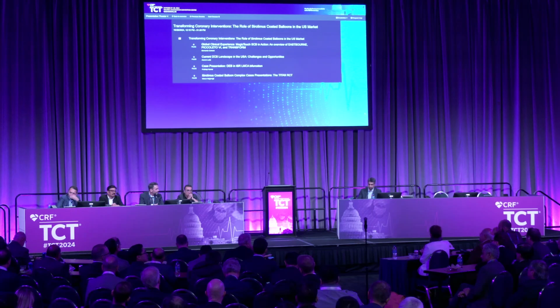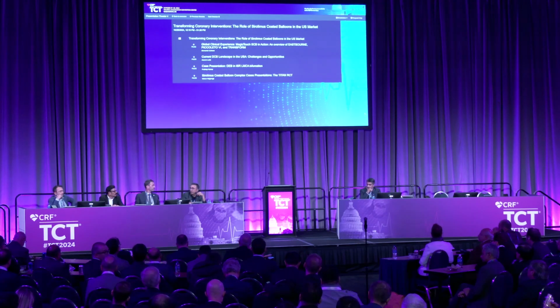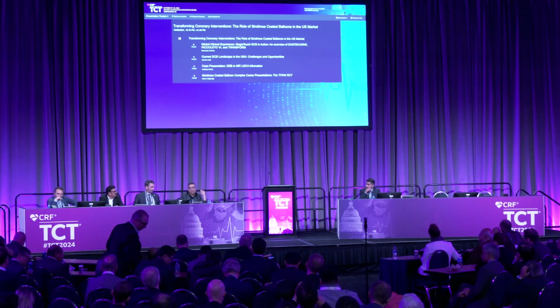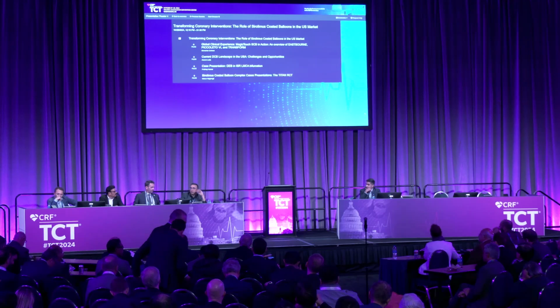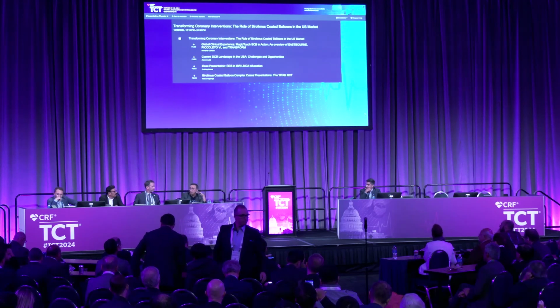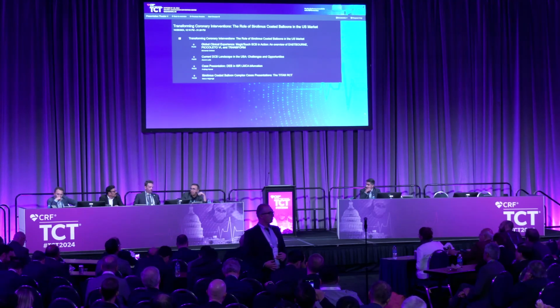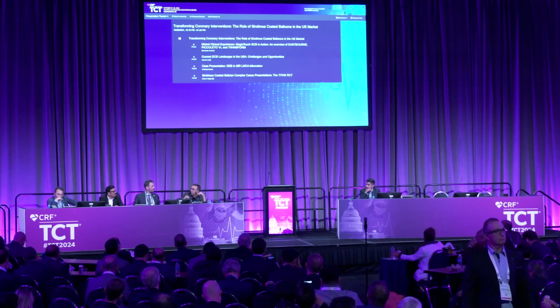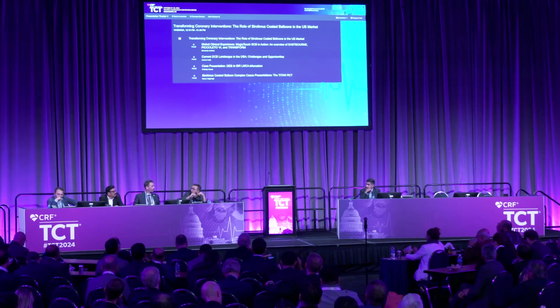Yeah. I guess the one big concern for many of us who see the data is, again, it highlights for me the fact that we all have to remember, and I'll say this again in my talk too, not all DCBs are created equally. There's no class effect. And when it comes to this balloon, there's very little preclinical or angiographic data that's been published on this balloon. So we don't really know how effective it is, right?